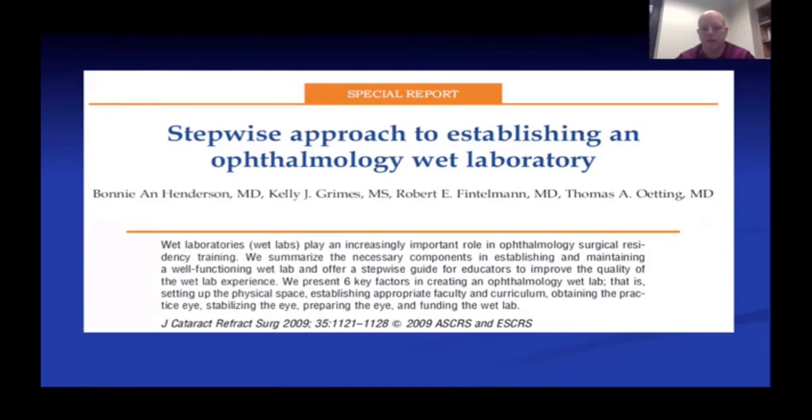I'll talk about our phaco curriculum here because that's what I have experience with. I think John Clements will talk about small incision cataract surgery, his experience with that. So, obtaining practice eyes, stabilizing the eye, preparing the eyes. Different regions of the world will have different animals available to them.